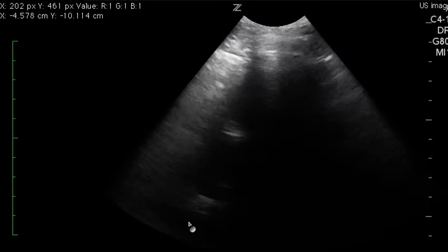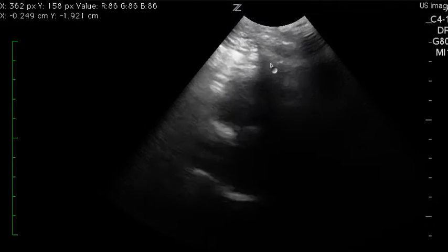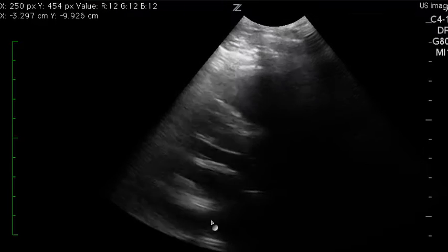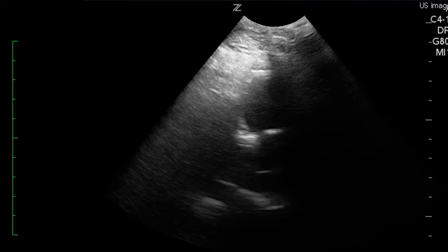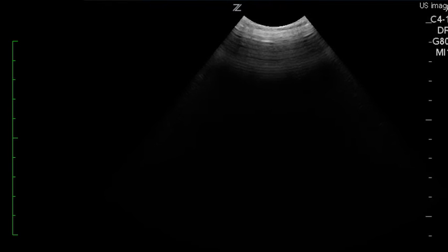And then here, you can see this is your LV down here, and you don't really have a good view deep. One issue here is that there's no contact to the skin, so this area of the probe is not touching anything, and so it's difficult to see exactly what is deep and below. So I would view this as you can't make a clinical decision based on the heart. And then a similar issue here where the probe just loses contact completely.